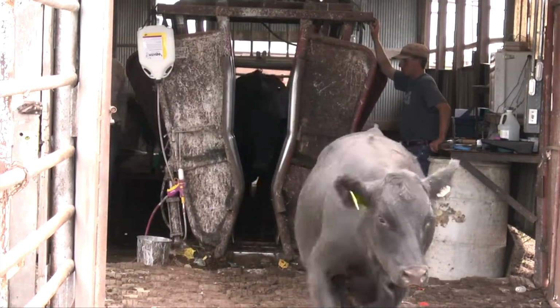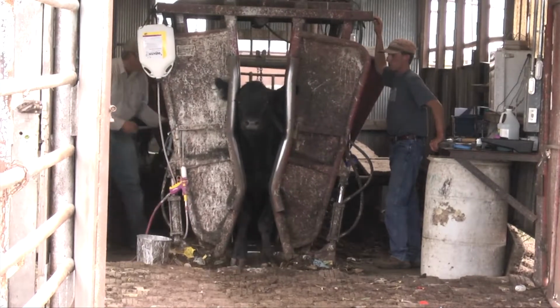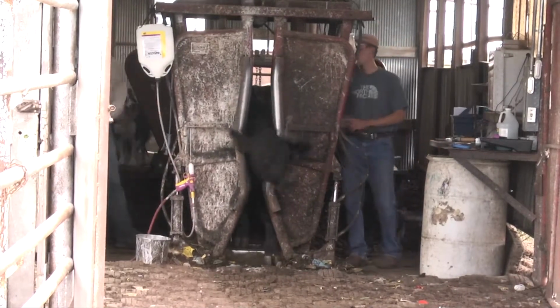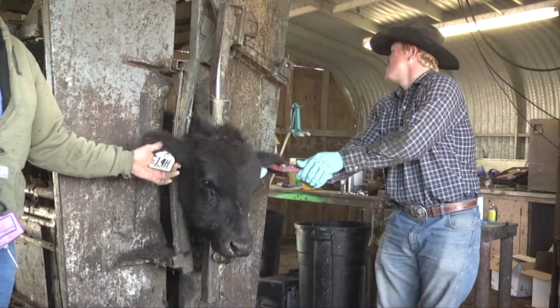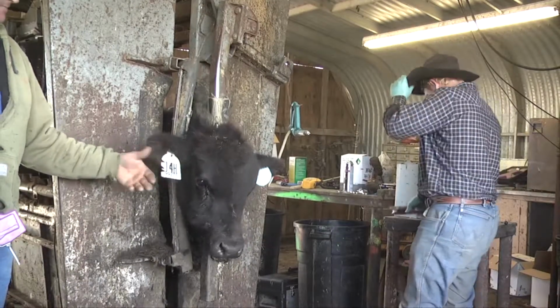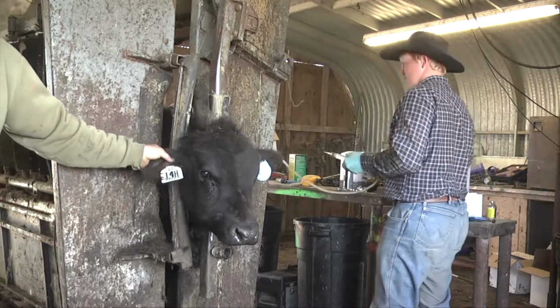If our animals are a little bit too excited or trying to jump up over the top of each other, that's where we actually can contaminate the outside ear where we're going to place this implant. So we want to have them calm, cool, and collected until they hit that head chute and we have proper restraint. We do need to have a head catch to make sure we can restrain those animals so we have easy access to the ears. We've even seen some of those neck extenders on chutes to hold the head steady for implanting.